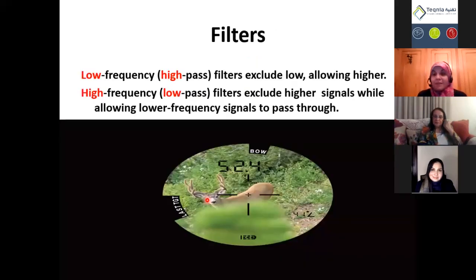Well, the filters. I don't like the filters. I always thought it is very difficult. So I like to put this here in front of the potential, as if this is the potential we are going to see. And the filters are the window we are going to see this potential through.